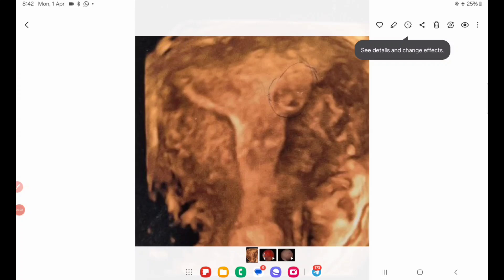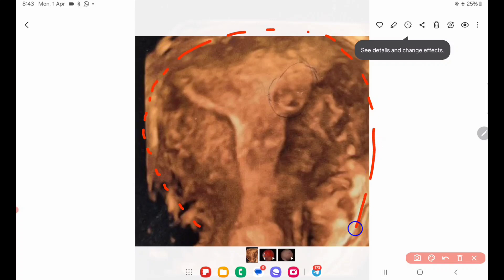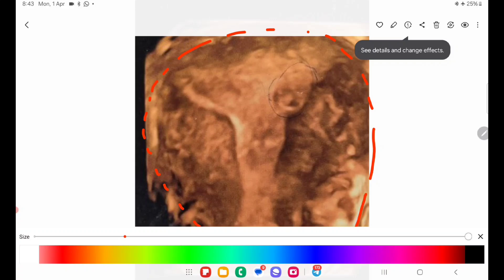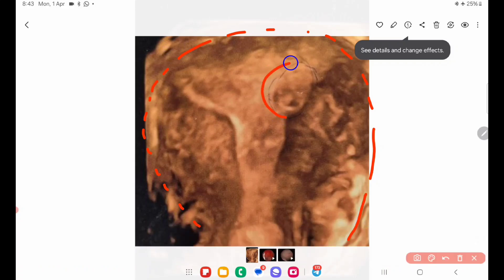Hello everyone. This is a case of a simple and straightforward hysteroscopic myoma resection for a type 0 to type 1 submucous myoma. As you can see, this is the uterine cavity clearly visible. There is a submucous myoma which is clearly indenting the endometrial cavity, and this requires removal because with this large space-occupying lesion, the patient will not be able to conceive.